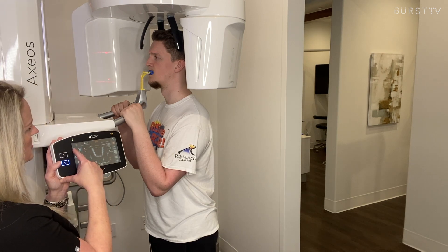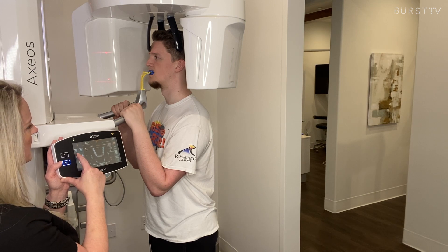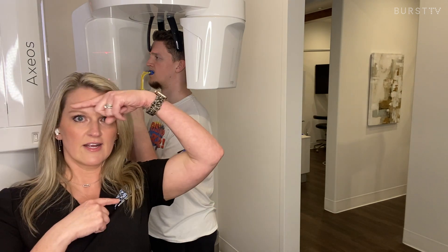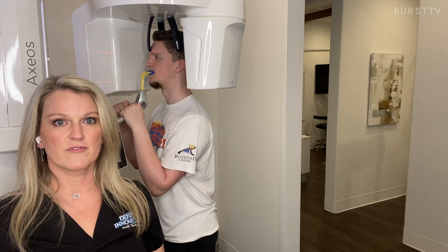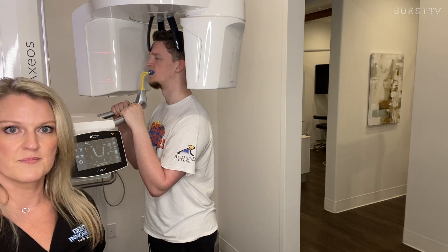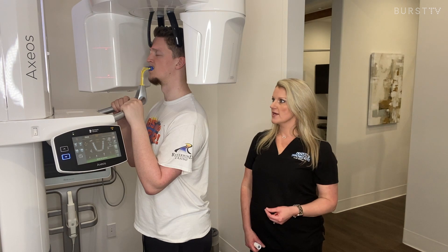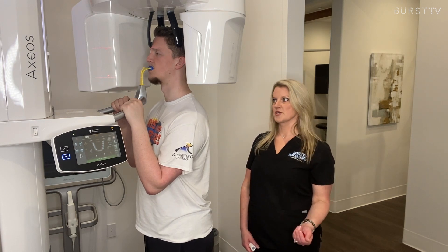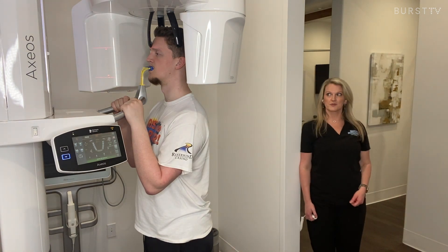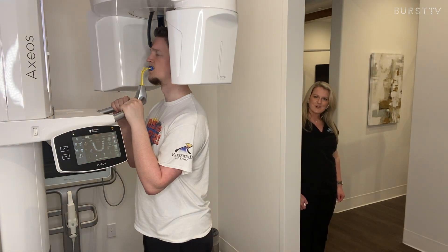We just kind of hold them in there and push this button to hold the front of his head in as well. Typically you would be looking for the ala-tragus line, but on this machine you actually have a light hair that goes across the forehead and the bottom of the jaw, making sure that we're getting from condyle to condyle and all the way across the mandibular jaw. Close your lips all the way around that piece of foam, swallow, put your tongue to the roof of your mouth, and hold as still as you can when the machine goes all the way around your head. I'm going to film the exposure so you can see — this one's really whisper quiet.